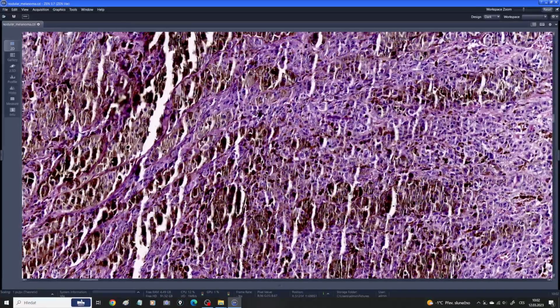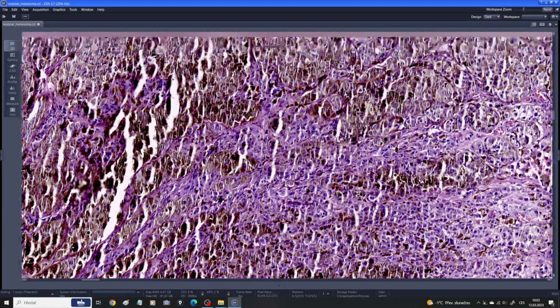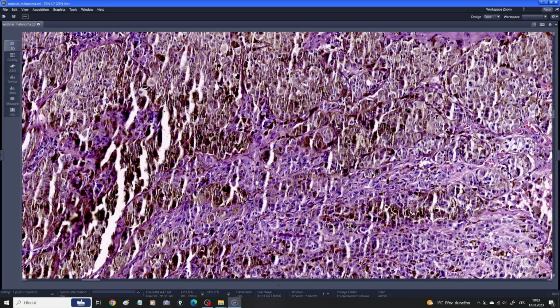But quite commonly, especially the advanced melanomas can lose the capacity to produce melanin because the cells are immature. So sometimes the melanoma can be completely devoid of any melanin pigment, and this can be problematic, especially in metastatic sites, because as I mentioned, the melanoma cells can be very variable with regards to their appearance, and very commonly they can lose the capacity to produce the pigment.